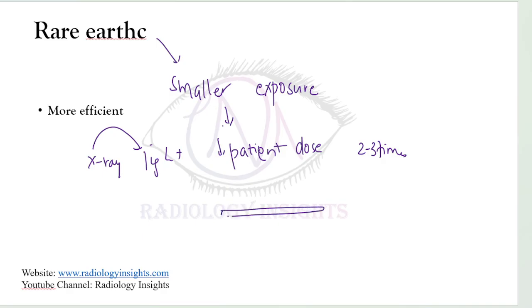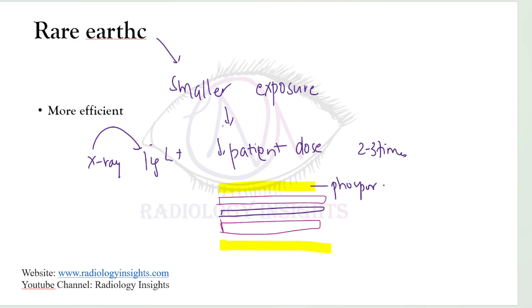The X-ray film is usually double coated with emulsion on both sides. Each emulsion is in contact with the phosphor coating of an intensifying screen. About 2/3 of the X-ray radiation falling on the front of the screen is absorbed by the phosphors, and this is converted into light.